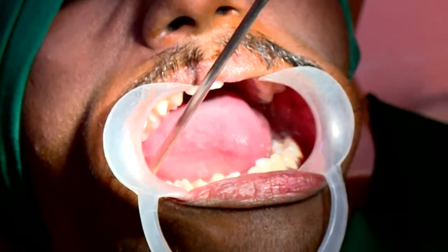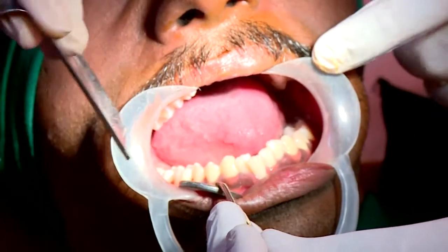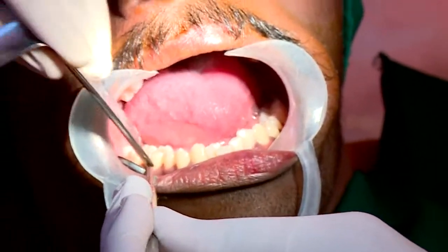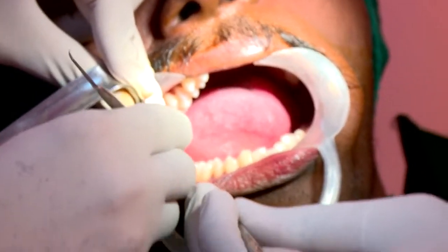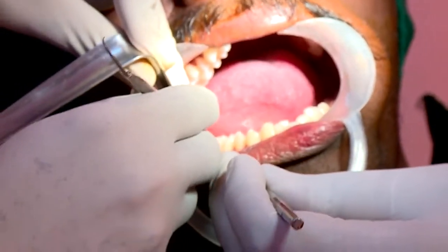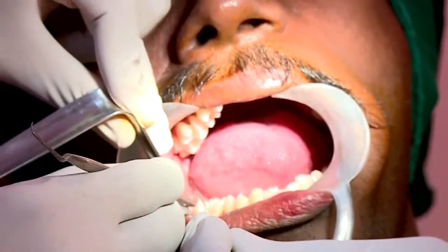Always remember that you should not split the papilla. The papilla distal to 7, you should either include it in the incision, or try not to split it. In a modified Ward's, the incision will be taken from the disto-buccal line angle, and you do not sever the papilla.